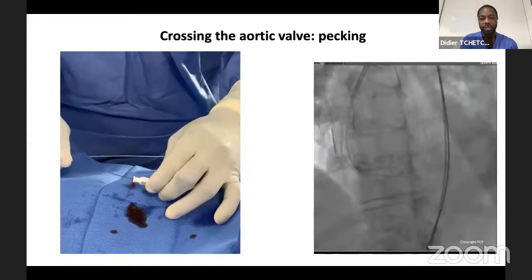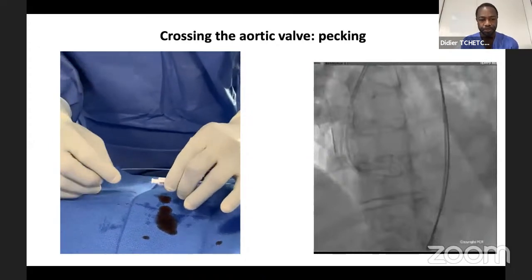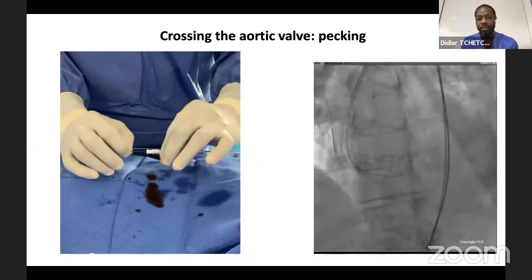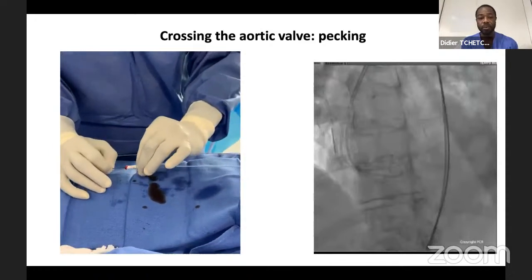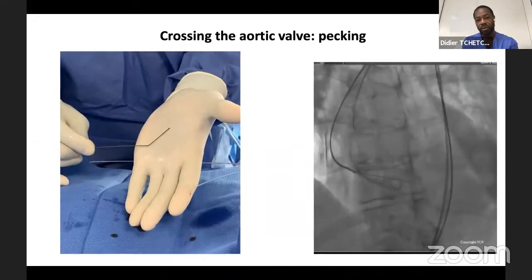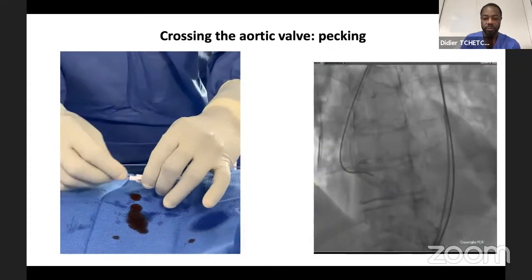For the pecking movement: one hand pushes the wire back and forth while the other rotates clockwise/counterclockwise and pushes the Amplatz Left 1. Adding that 30-degree angle on the wire is very useful for crossing.